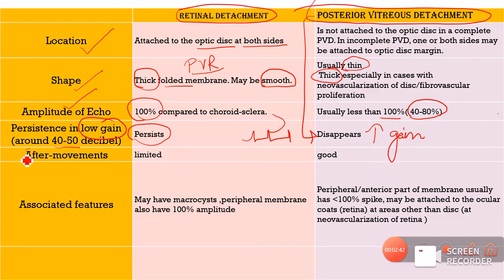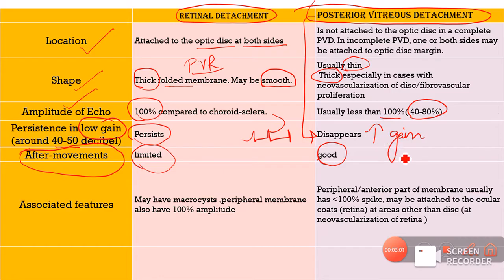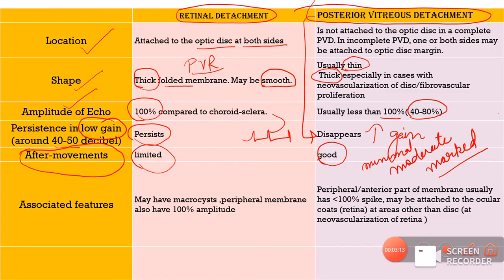Another way to differentiate between RD and PVD is based on after movements. A retinal detachment will have lower after movements compared to the posterior vitreous detachment, because vitreous is always more mobile compared to the retina. We can label after movements as minimal, moderate, and marked. In case of a PVD, it is always marked after movements. However, in case of a retinal detachment, it is moderate after movements. Where we see minimal after movements — I will tell you at the end of the video.